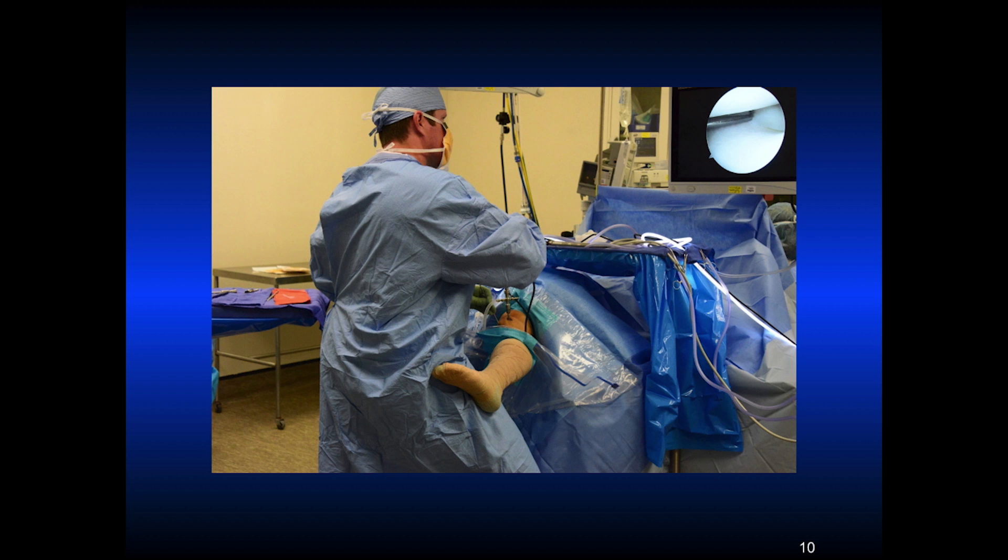Make the medial portal big enough where you have some water coming out, because patients oftentimes will have pain over the medial portal if it's made small and you can't get instruments back and forth. Most of the instrumentation is done through the medial portal; if you make it too small that will cause the synovium to get very upset, thickened, and the patients will have medial pain. You can see in the upper right that's our scope picture — he's got the medial compartment open enough where there is no damage from the scope on the articular cartilage of the medial femoral condyle. You have to change the degree of valgus force applied, and sometimes the degree of flexion and extension. Most of the time the meniscal pathology is in the back of the knee, so we have to open it up enough to get back to that posterior third of the medial meniscus.